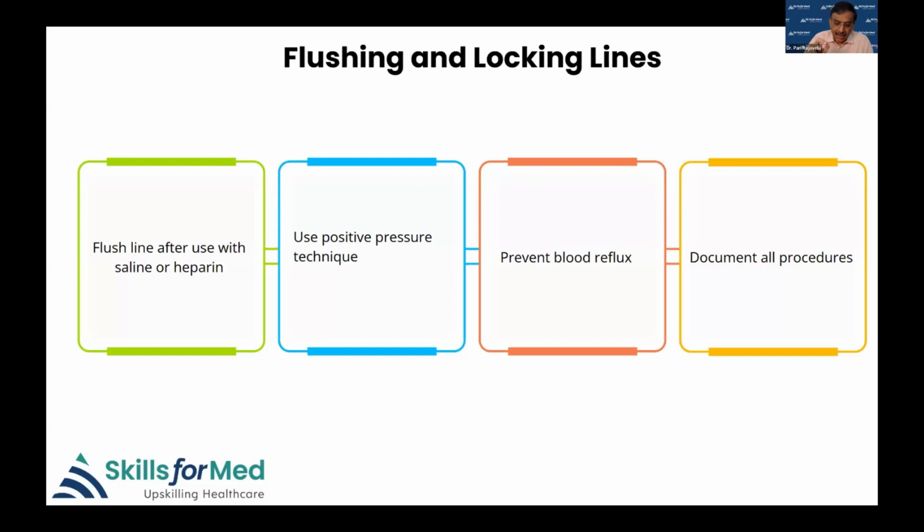So prevent blood reflux, so that the lumens of the line don't get stained with blood. And of course, you need to document that you have flushed and locked the lines. Next slide.